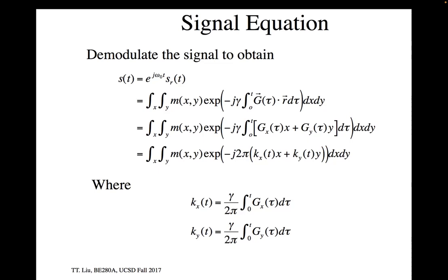And so what this is doing is just, if I have my kx in this direction, ky in this direction, this function here is just moving kx and ky through that space.